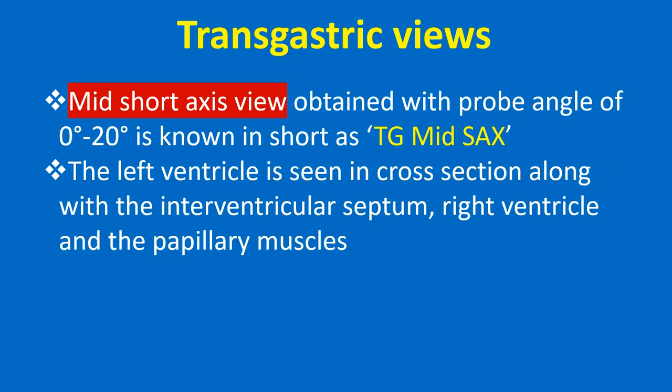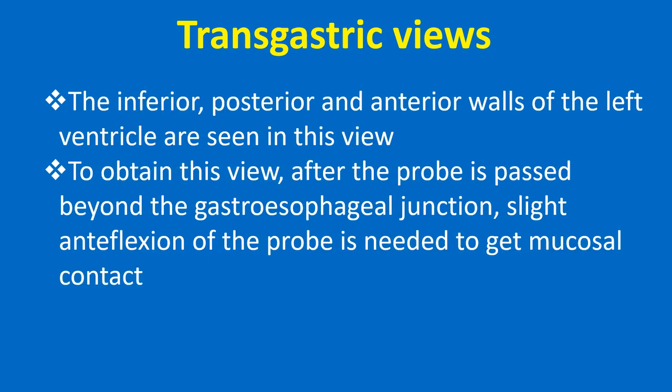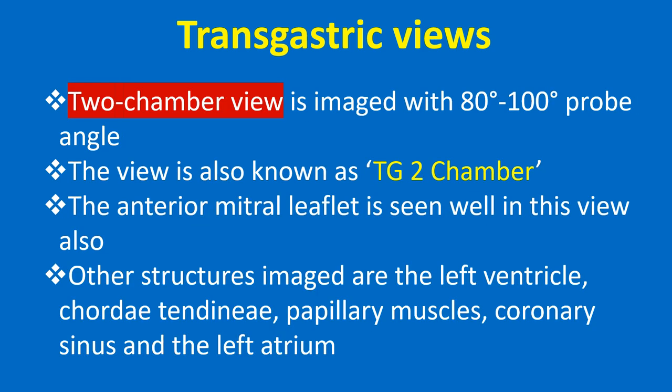The mid short axis view, obtained with probe angle 0-20 degrees, is known in short as TG Mid SAX. The left ventricle is seen in cross section along with the interventricular septum, right ventricle, and papillary muscles. The inferior, posterior, and anterior walls of the left ventricle are seen. To obtain this view, after the probe is passed beyond the gastroesophageal junction, slight antiflexion of the probe is needed to get mucosal contact.